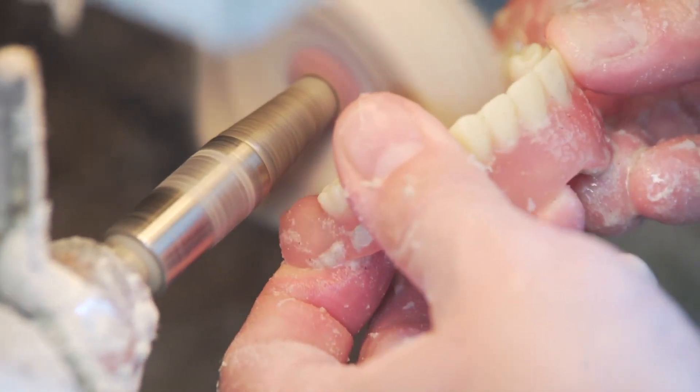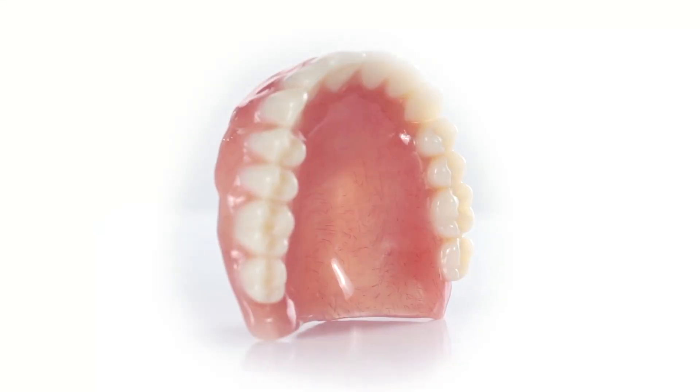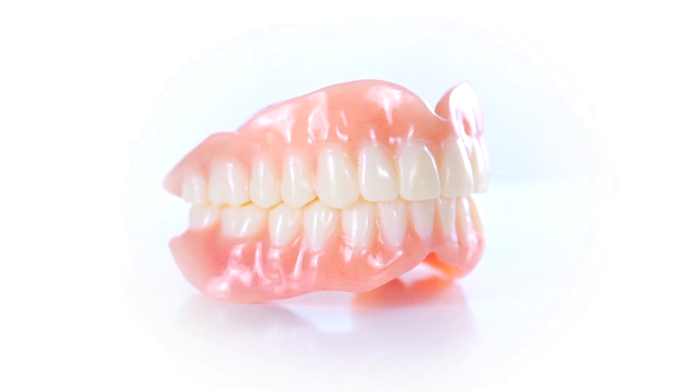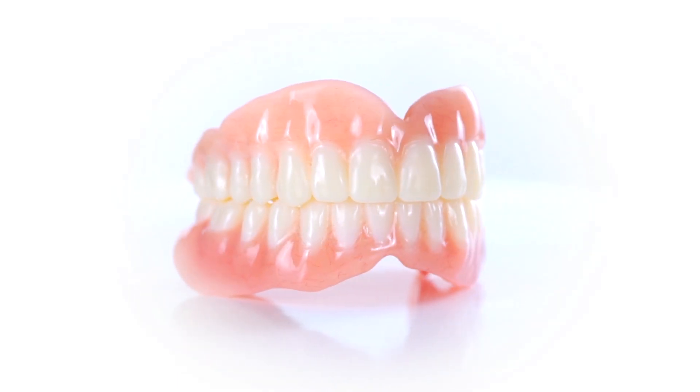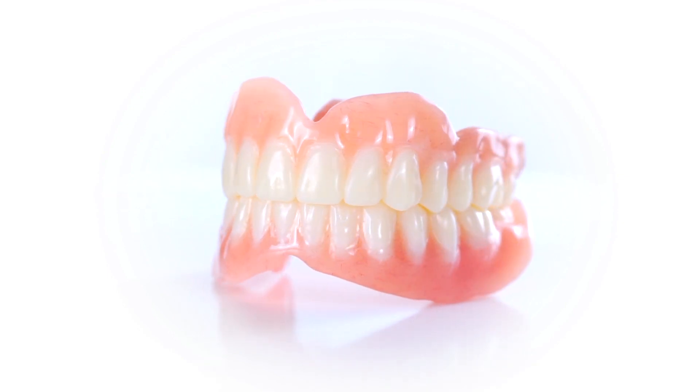Utilizing Keystone Industries Diamond D, each Key Mill denture base disc produces a final denture with translucency to pick up light and fibers to simulate veins and natural coloring. The final denture not only looks great but is durable and able to withstand immense pressure and common damage such as dropping.